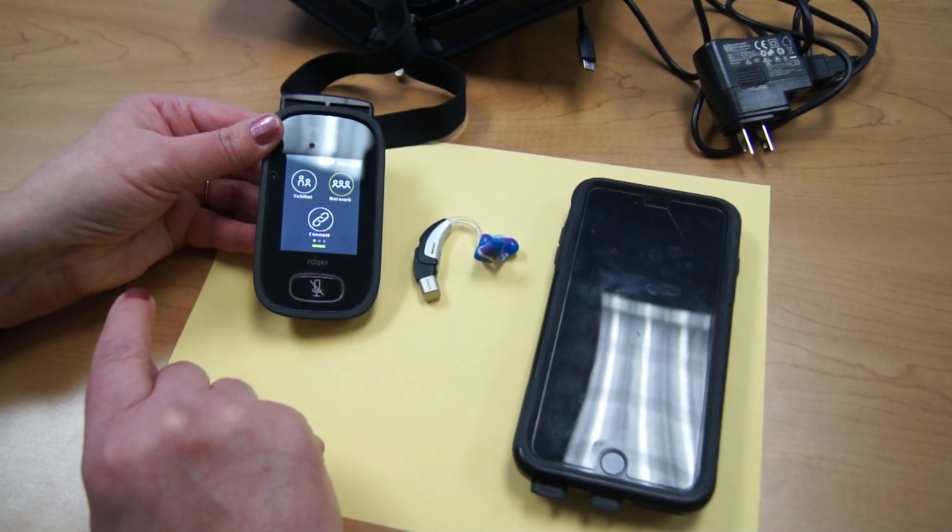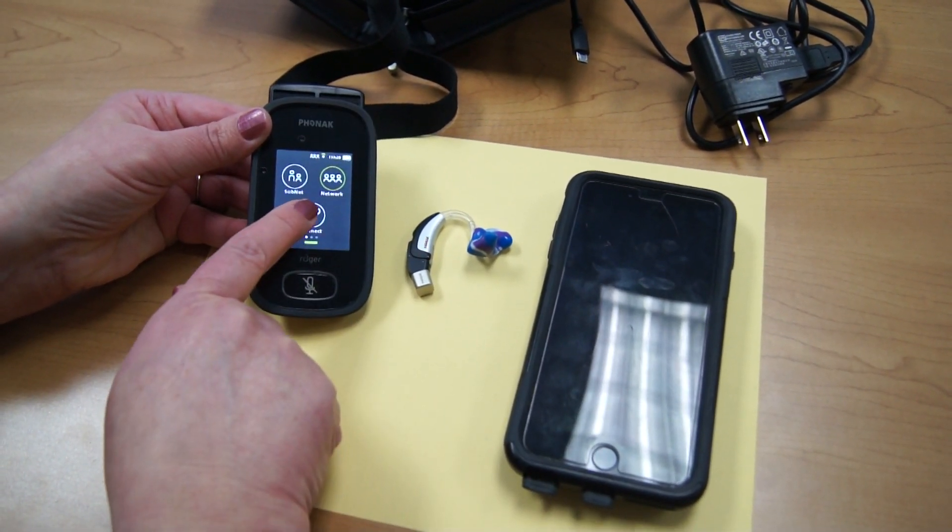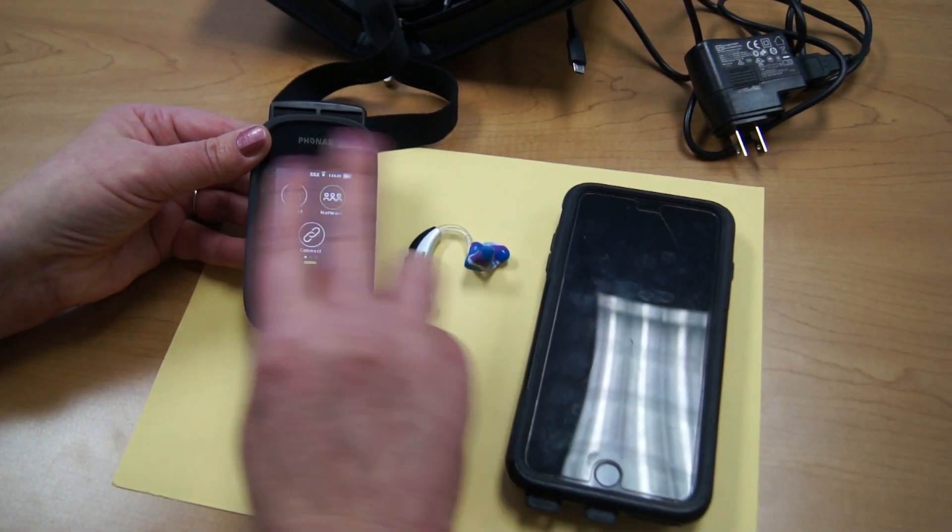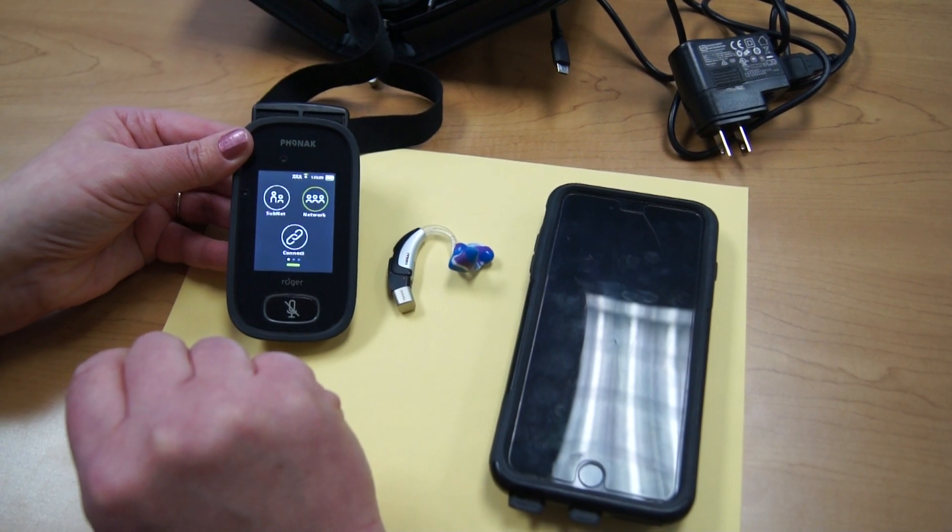When you want to connect, you need to be three to five inches from the hearing device and hit the connect button. You'll see Roger X connected and you're ready and they're synced together so they will hear each other.